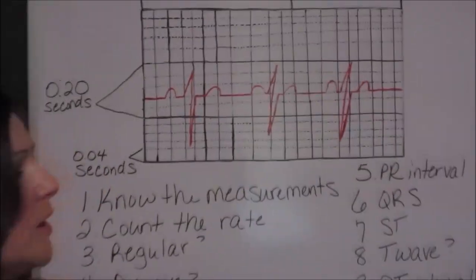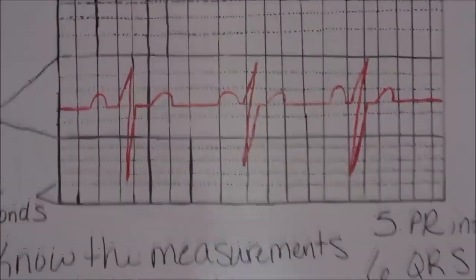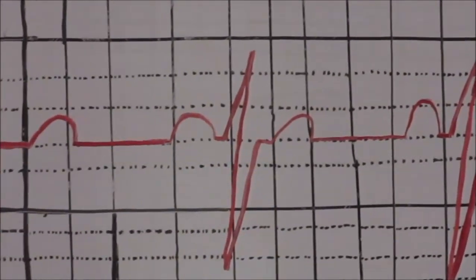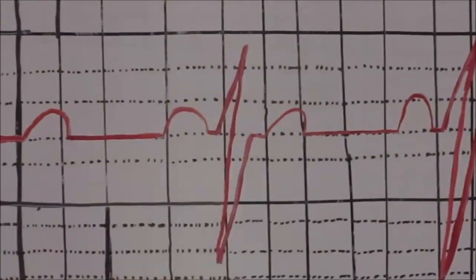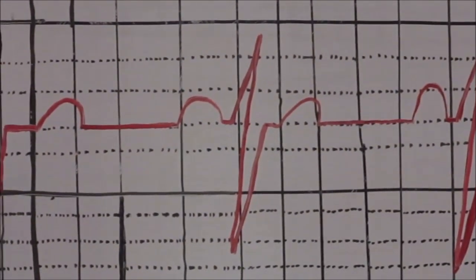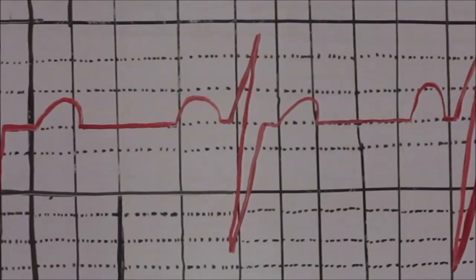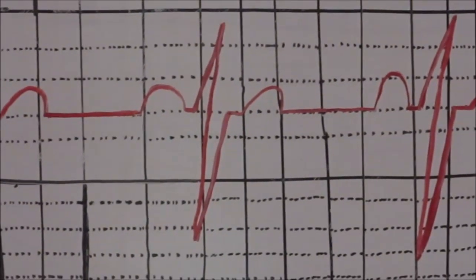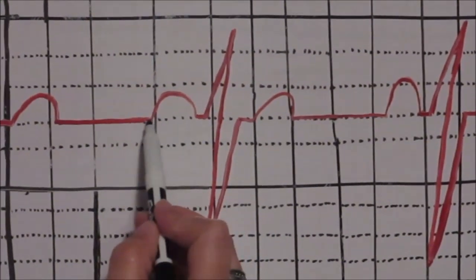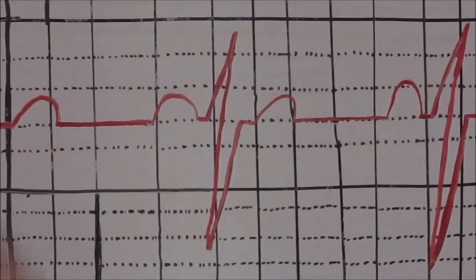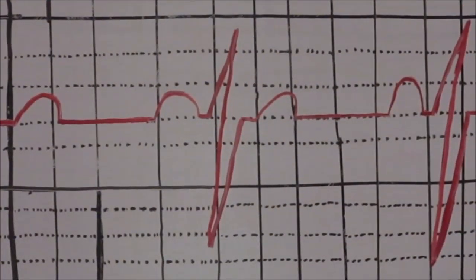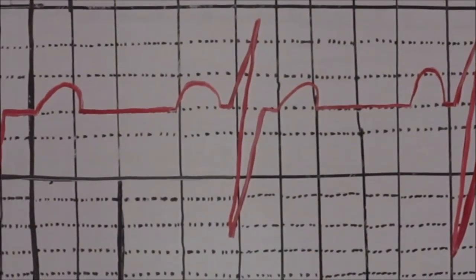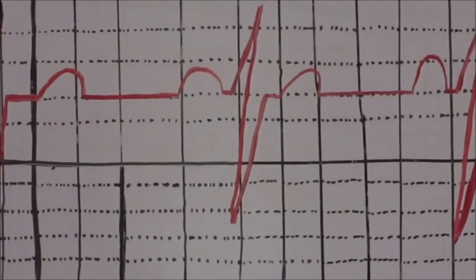PR Interval. For the measurement part, I am going to use this middle complex. I have always said why don't we call this the P-Q interval. To measure the P-Wave, start from the beginning of the P-Wave to the beginning of the Q-Wave. Count the number of boxes.